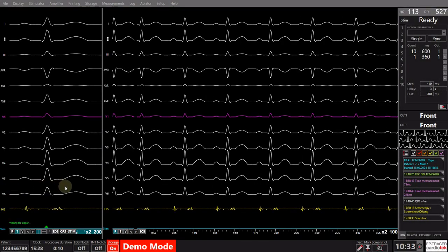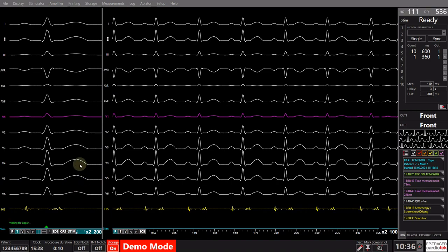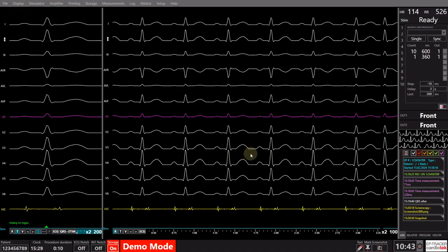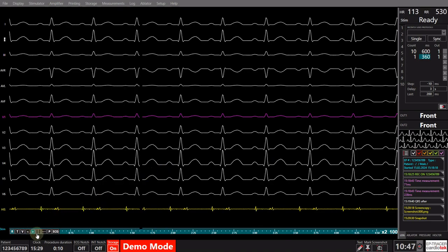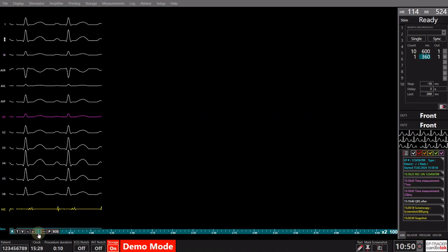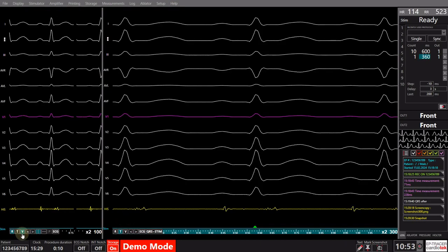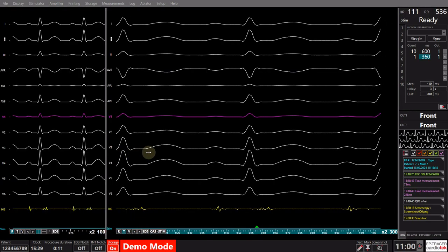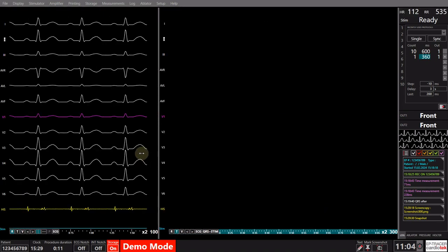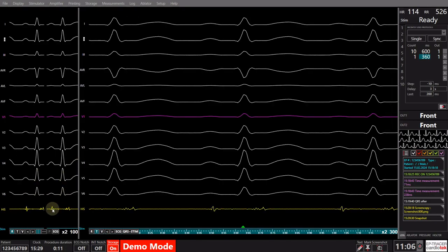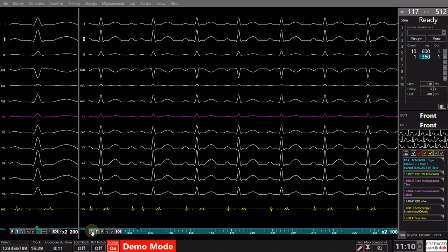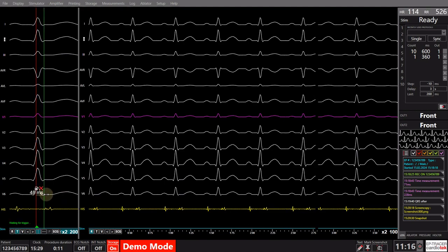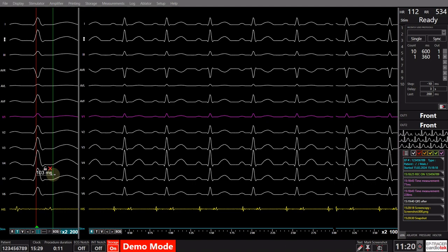For optimal signal display, it is recommended to split the screen, featuring a triggered view of a single beat on one side and a real-time view of continuous signals on the other. To achieve this, utilize the button situated in the lower left side of the screen. Once the screen is split, you gain individual control over each segment, and you can adjust the space allocated to each split by dragging the divider. This split screen setup proves particularly advantageous when assessing timing on the go, as the triggered view allows for the setup of calipers for precise evaluations during the intervention.